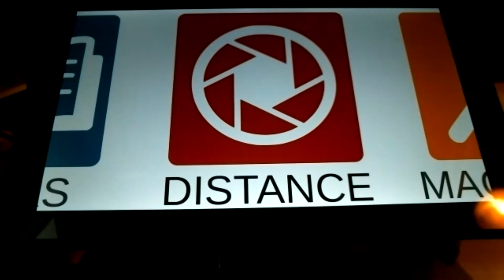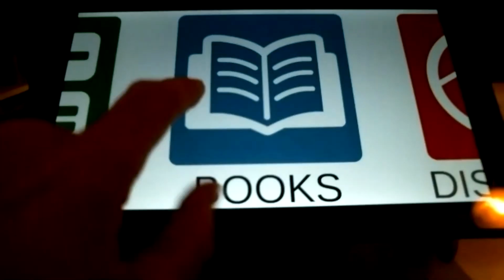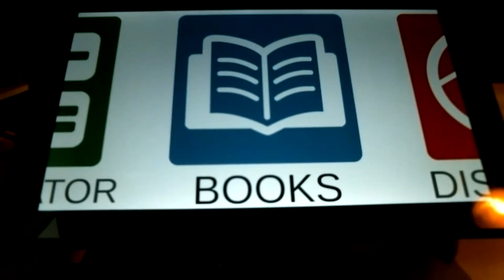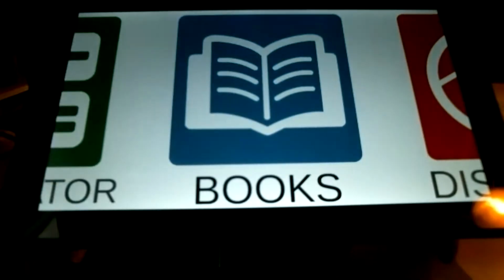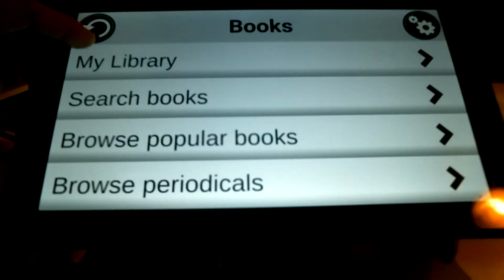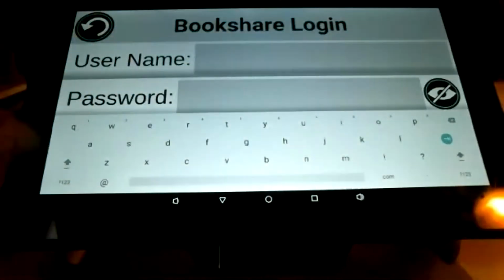So we've connected, we've reset the whole tablet, we've connected to the stand, we've configured Prodigy to be your home application. We have connected to my distance camera. And there was one thing that I'd like to show you also, that I frequently get as a question: can I change the color of the virtual keyboard? So for this, I'm going to go into my books application just to get a text box open here. I'm going to go into my library, and then I have my keyboard that just popped up at the bottom.